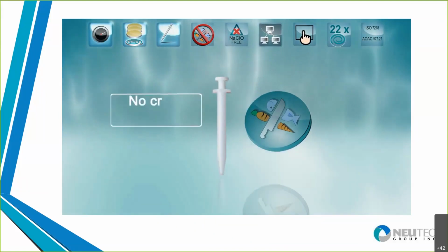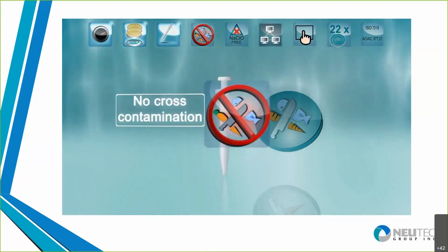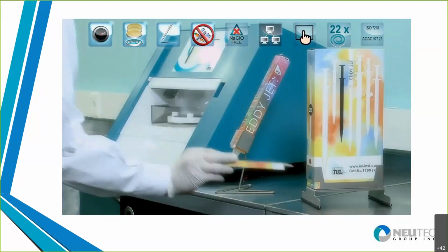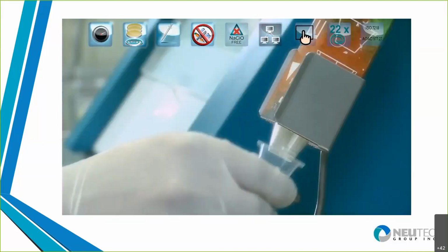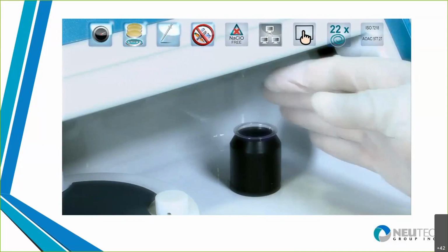So you simply just keep a stock of those. You place them in the instrument. The instrument can go and grab them, and knows how much to dose based on how you program it. And so it's a real straightforward process. So here is how you load the tips. They just basically set them in there. You get one of the cups to place your inoculant in. Once you have the inoculant, you place it in the system, and then you start it.